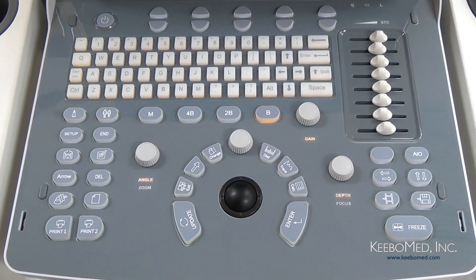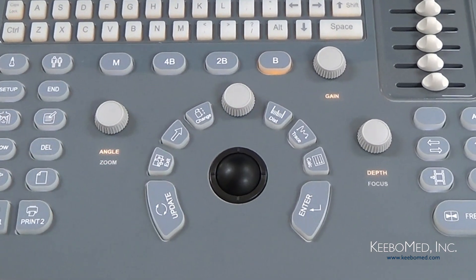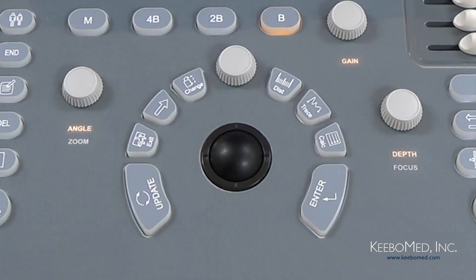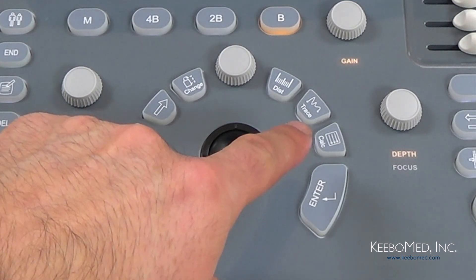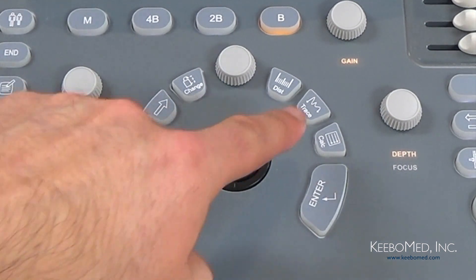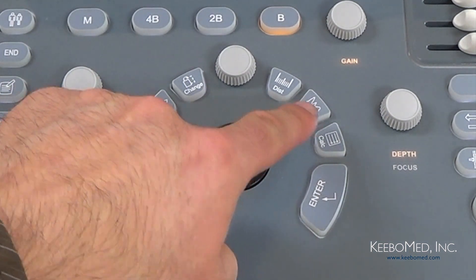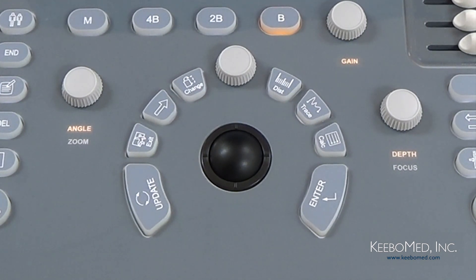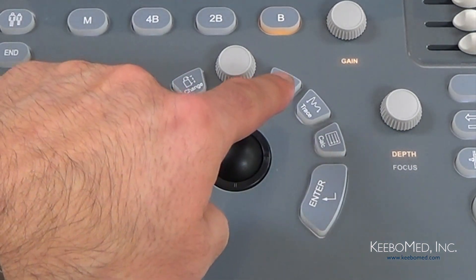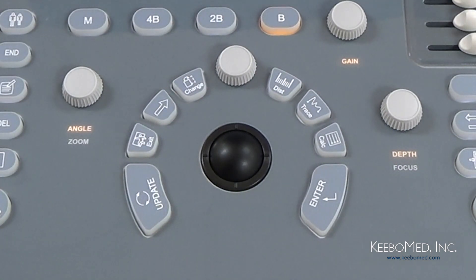Let's take a closer look at the keys surrounding the trackball and take note of their functions. First we have the Enter key, which is used to make selections when using the trackball. Next to that we have the Calc key — pressing this allows you to enter the measurement software package and select the preferred choice. Then we have the Trace key, which allows you to make specific measurements based on a traced area. Next to the Trace key we have the Distance key — press this key to make measurements of a desired distance.